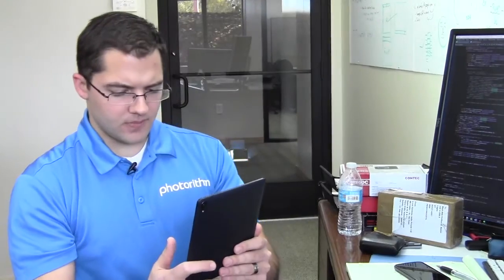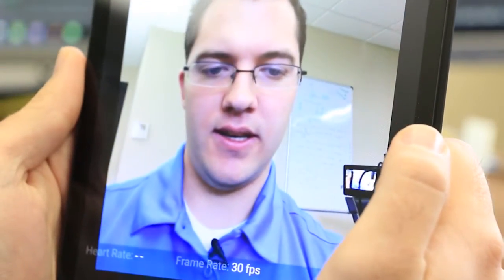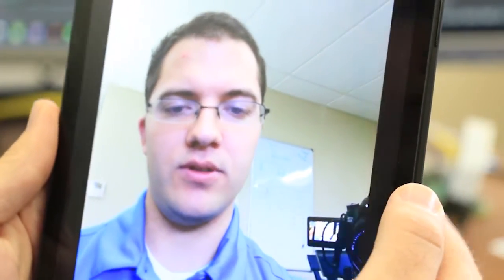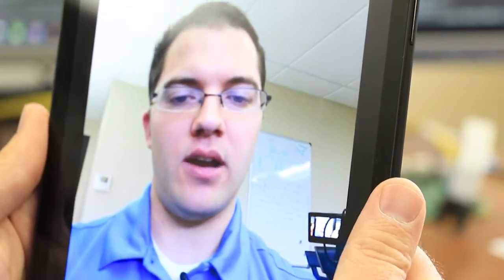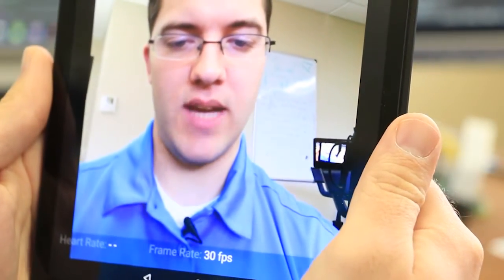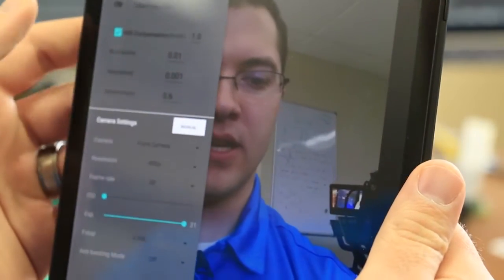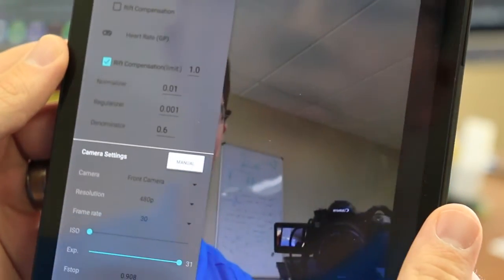As I open up the app, I'm presented here with a viewfinder, and this is an internal app that we use to validate our algorithms and how they run in the wild. So I want to show you some of the settings and controls that we have available here. If I swipe from the left, I have quite a few options available to me.